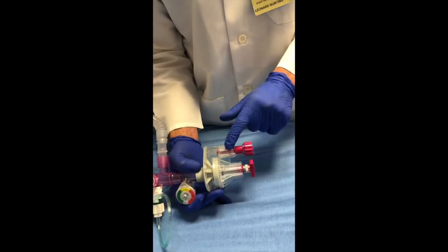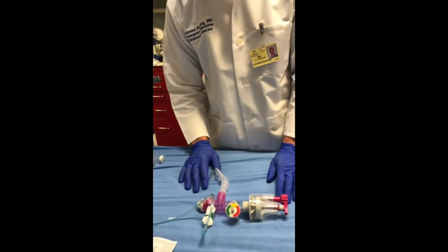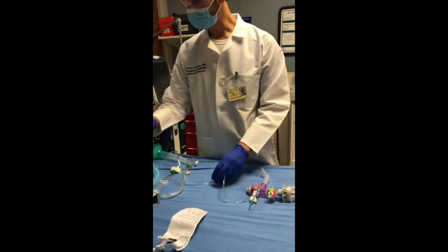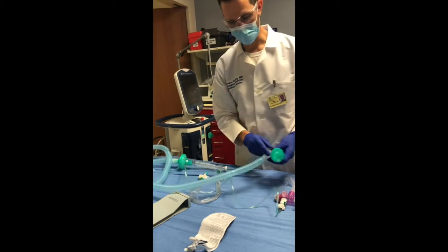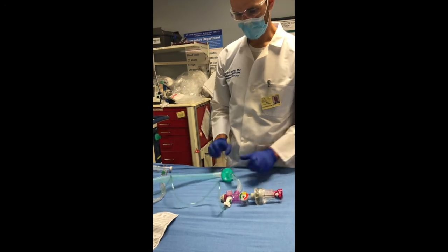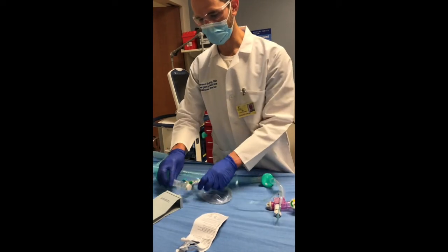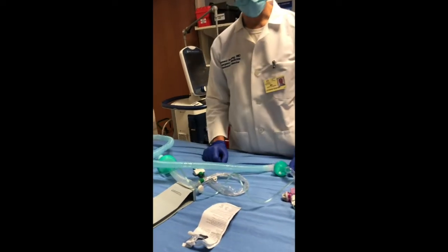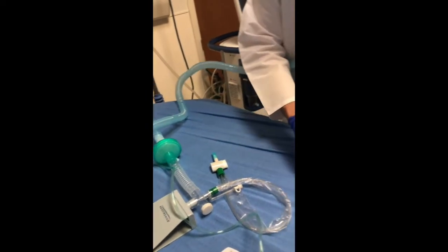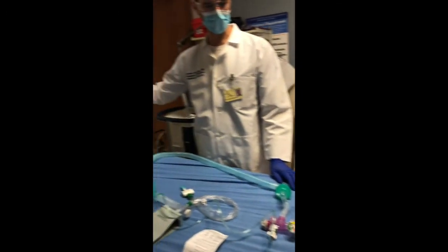There's a little bit of interplay between the two controls, so as you change one it will oftentimes change the other. Now I'm going to set up the patient. This is a standard patient connector, so we're going to put on a green filter, which is a bacterial and viral filter. We have our standard vent tubing, and then we have this hooked up to a test lung — this is an ARDS lung, but this would be hooked up to our ET tube. Our connection is now set for a single patient.